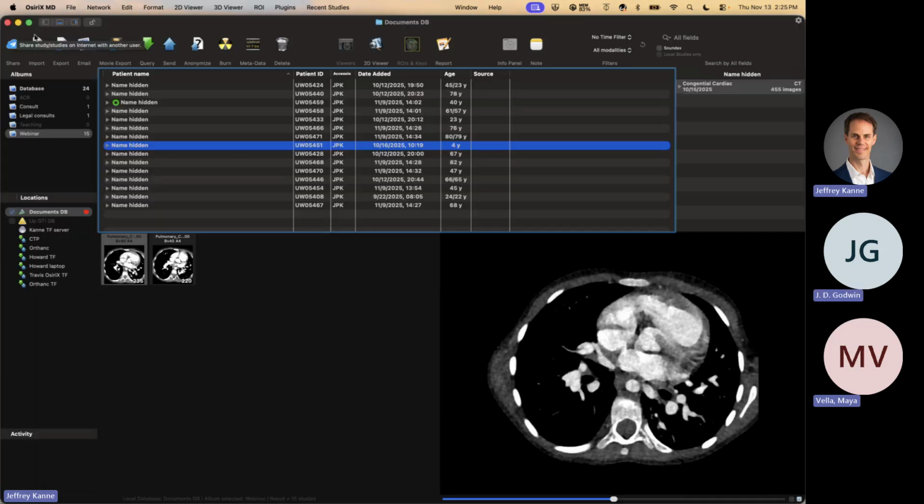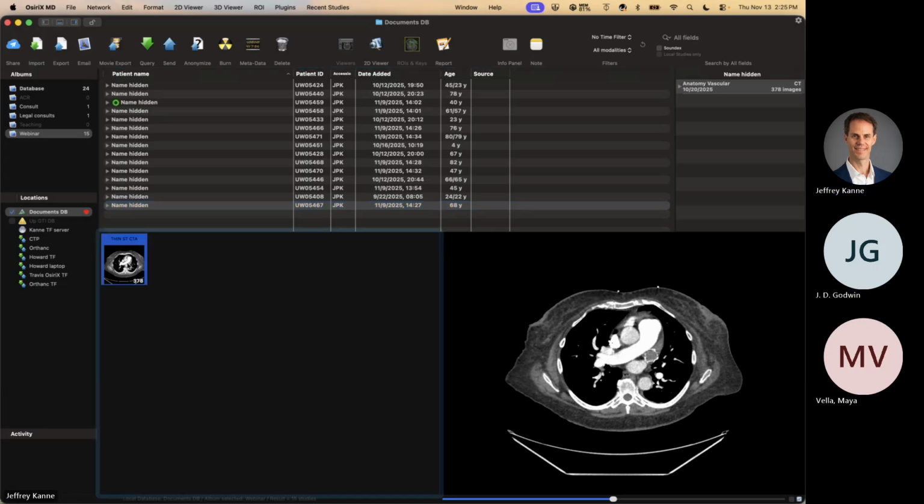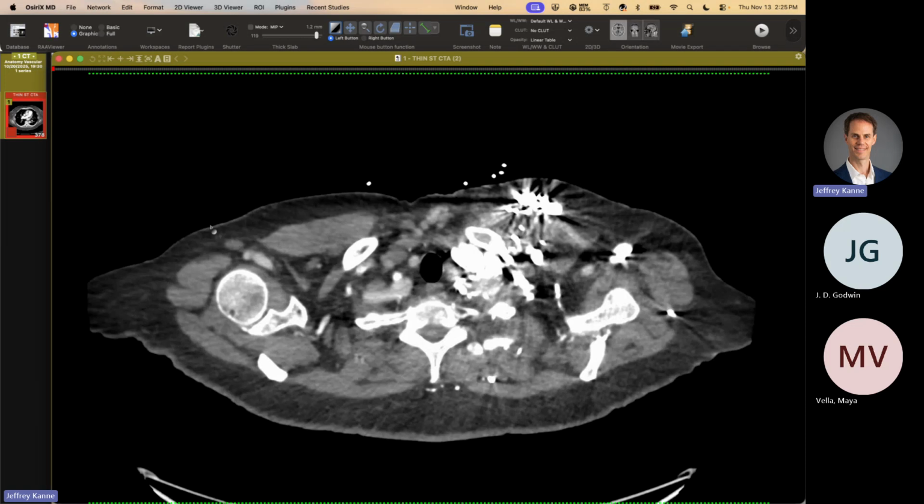Really interesting. Okay. And then this was a 4 year old. Yeah, I think 4 years old. It was not a neonate. So not doing that badly then. I mean, usually they're cyanotic, right? But I guess the sinus venosus ASD was big enough.